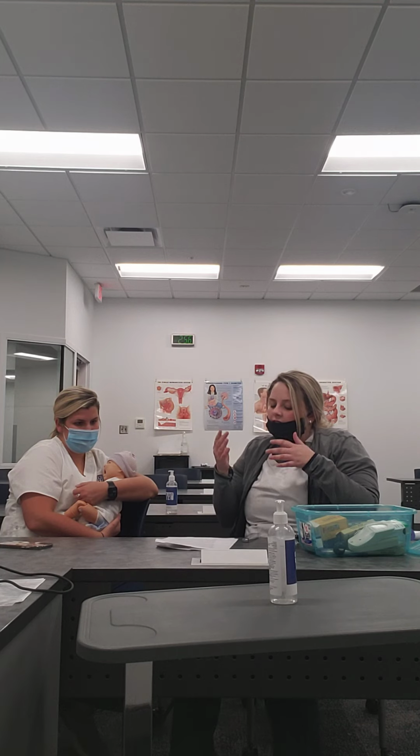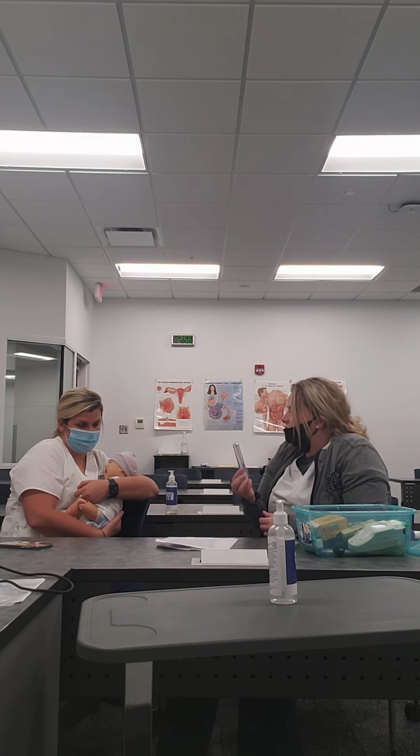Okay, so like I said, there are different types of thermometers. Many people in households will just have the regular digital and they'll just do oral. So we have the digital thermometers, the tympanic, which is the ear, and that's this one, and then the temporal, which this isn't really a temporal, but semi the same. The temporal ones you touch and go behind the ear. Yeah. So there are things called digital pacifier thermometers, and then fever strips, but according to pediatrics, they don't really suggest that. It's not as accurate. So if you see those, I would suggest just buying a digital thermometer, because being new, I don't know if you're breastfeeding or if you're not. I mean, they're prone to infections.